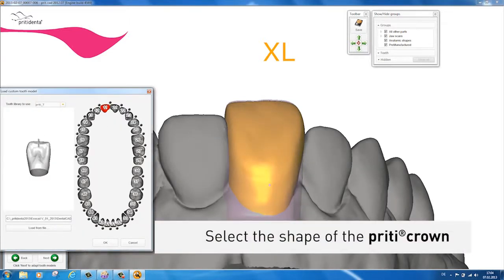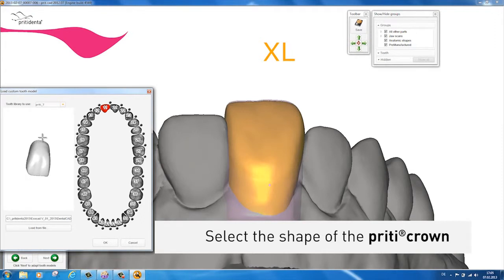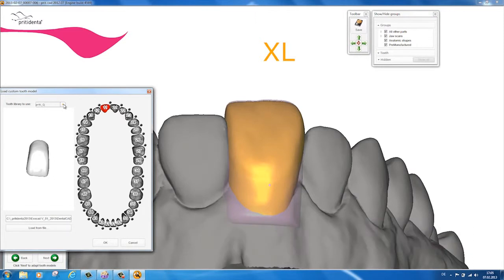Now you can select the shape. You can choose from Q, square, athletic; R, round, endomorph; and T, trapezoidal, leptosome.